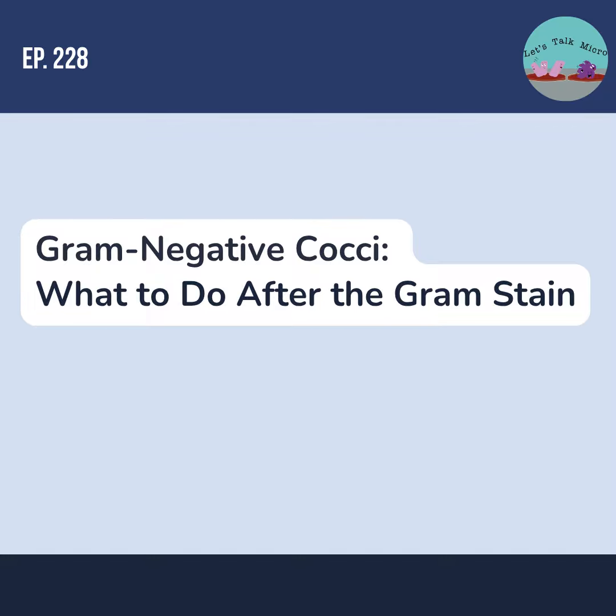These are selective media. We also talked about the ONPG test that can help differentiate between Neisseria meningitidis and lactamica. And we talked about the carbohydrate utilization test. And then we talked about the catarrhalis disc. So we have all these tests that are manual, and we have to learn them in school, right? In many parts of the world, they still do them heavily. But let's go ahead and, in the next episode, talk about modern approaches to testing. And of course, we have things like MALDI, we have Vitek, and then there are nucleic acid tests and molecular tests. So let's talk about those in the next episode.